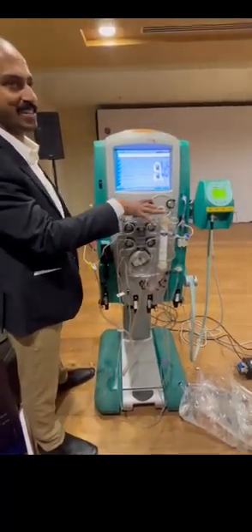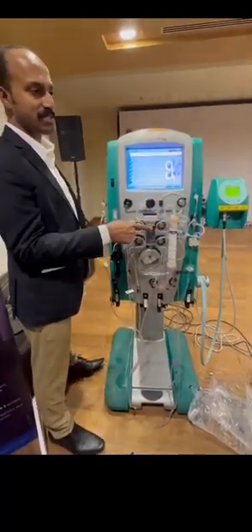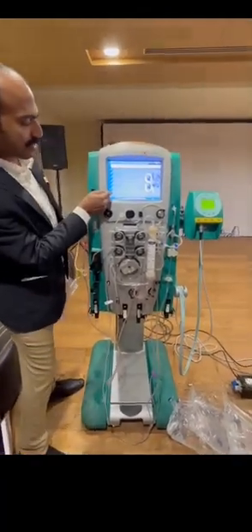We can't purchase it like that, only the cartridge. What is the cost of this cartridge? MRP is 18,000. Okay. So the last, what it is saying, open the effluent.